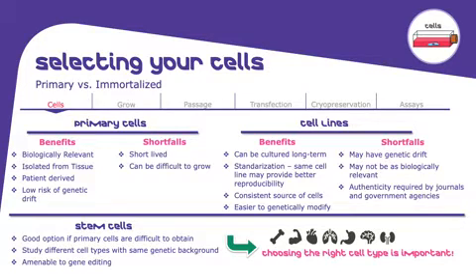They are not as biologically relevant as the primary cells or the stem cells. They do have a genetic drift, and also authenticity might be really in question here. So take that in consideration as well. Stem cells, currently considered the most biologically relevant source for studies, are not so easy to work with. However, they're really potentially used for gene editing and other manipulations as well.